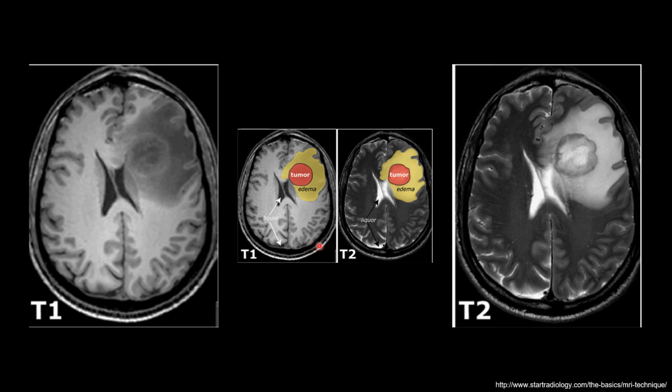Again here, this is just showing the difference in T1 and T2, looking at the liquids or the fluids, and then judging that this is the edema around it based off of the fact that it's following the fluid signal intensity between the two types of imaging, or just sequences, I should say.